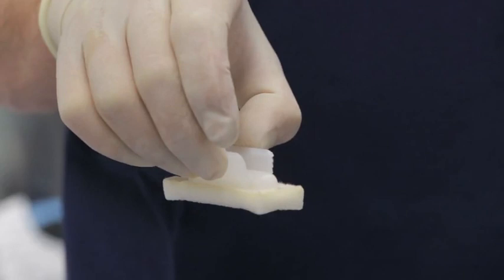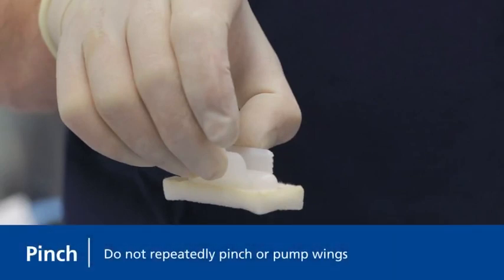Discontinue squeezing and let the solution flow down into the sponge. Hold horizontally to aid even spread of the solution through the sponge. Do not repeatedly pinch or pump the wings in an attempt to accelerate saturation of the sponge.